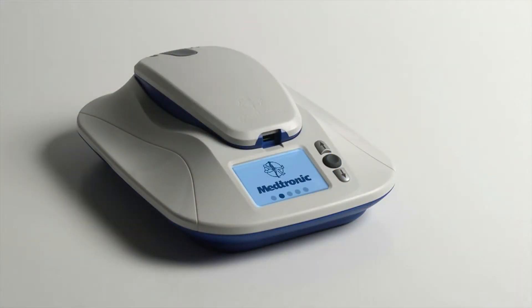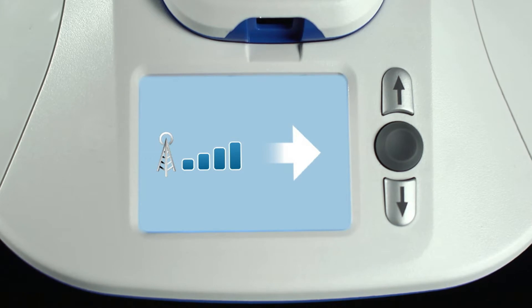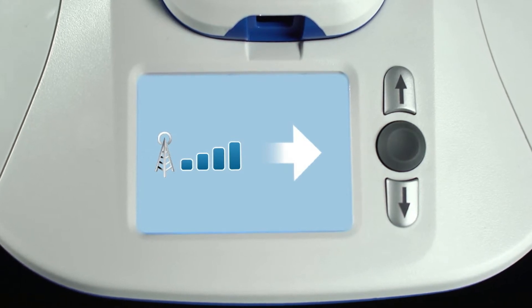After you plug in the monitor, the Medtronic logo will appear for a minute or two while it powers on. Then, you should see this icon which indicates the monitor is connected to a cellular network.